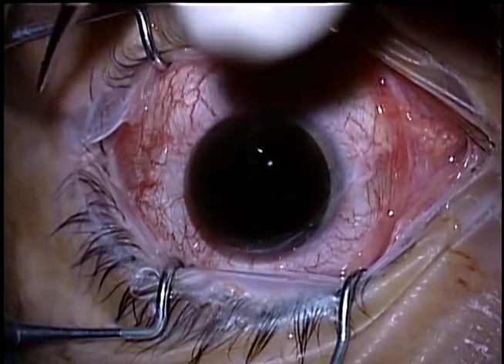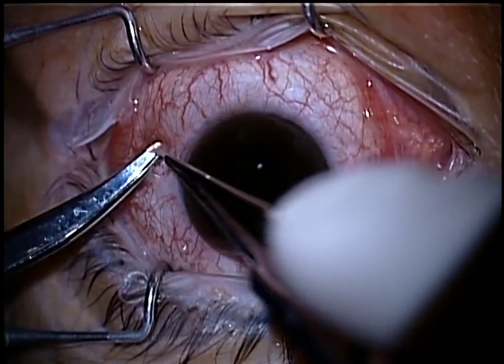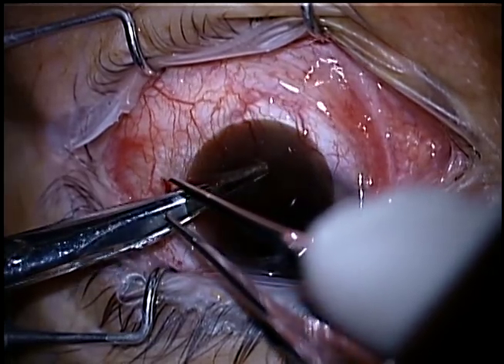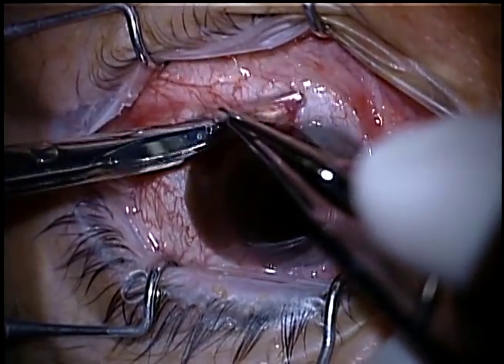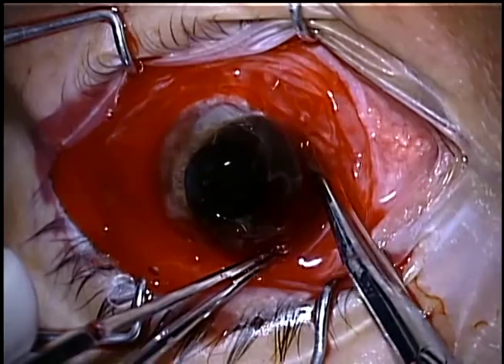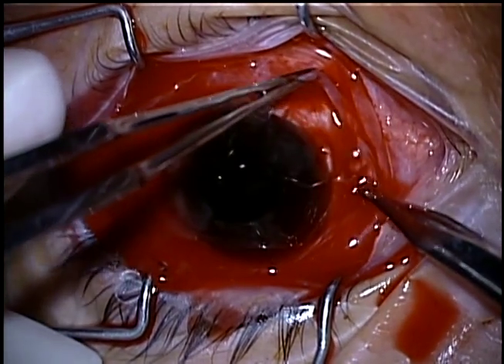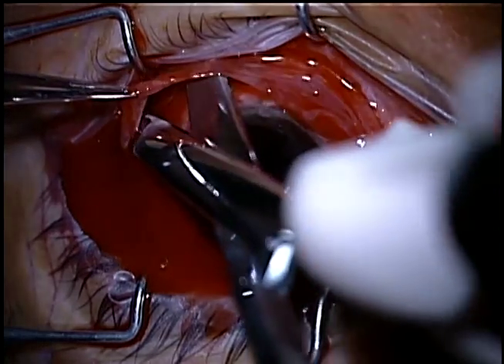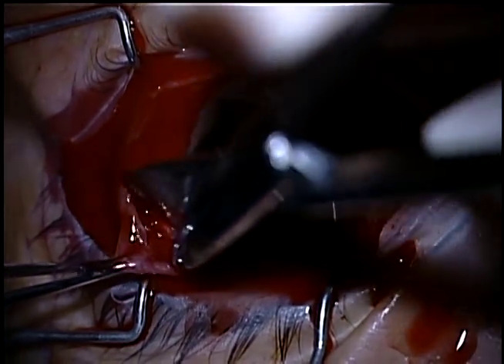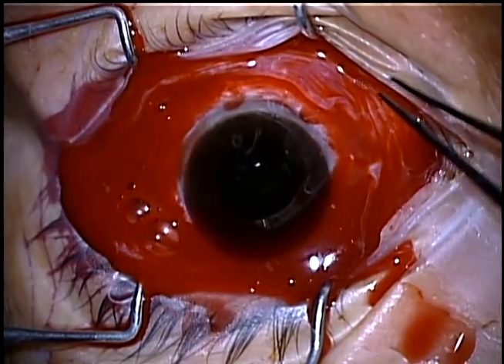Here I'm making an incision in the conjunctiva, which overlies the sclera. The conjunctival incision is extended 360 degrees around the limbus, or the edge of the cornea. This patient was on aspirin for a heart problem, so there was more bleeding than average. Now, scissors are being used to separate the conjunctiva and the Tenon's layer from the sclera in each of the quadrants between the four rectus muscles.